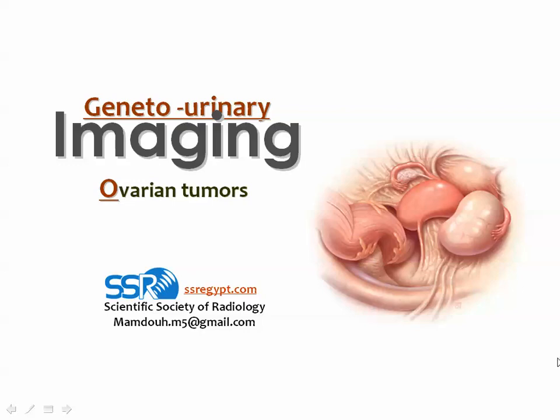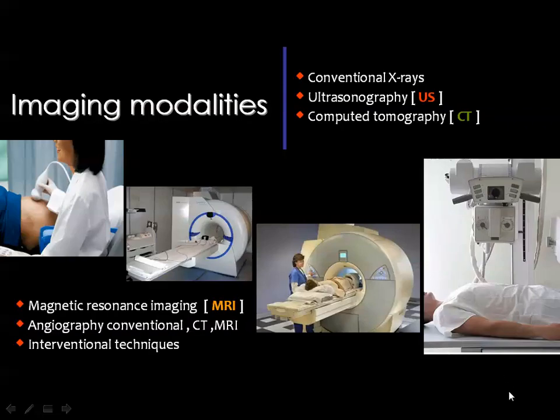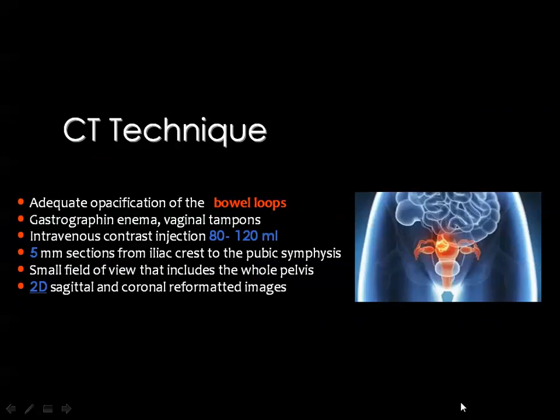Ovarian masses. You know that we have many imaging modalities to assess the pelvis, especially the ultrasound, the CT and MRI, and we may have a role for the plain X-ray to get some idea about what's going on in the pelvis, as I will show you.